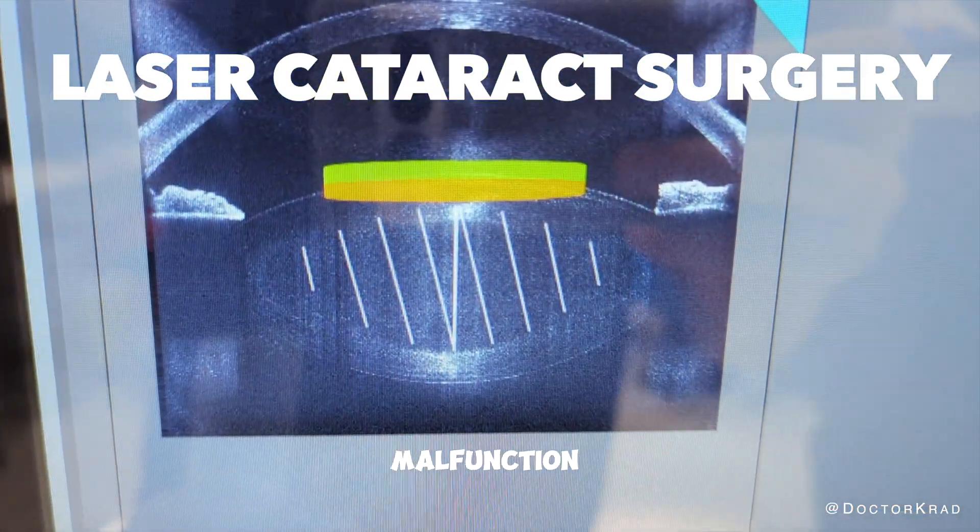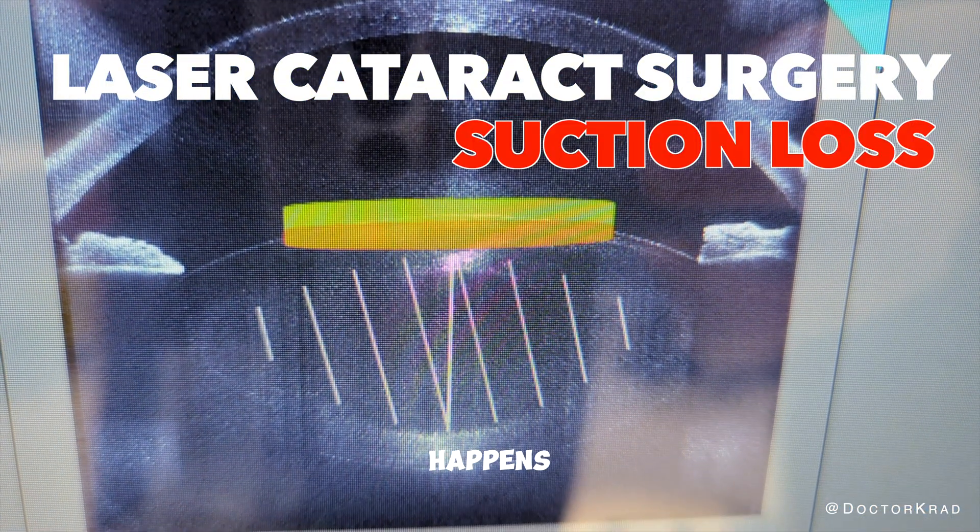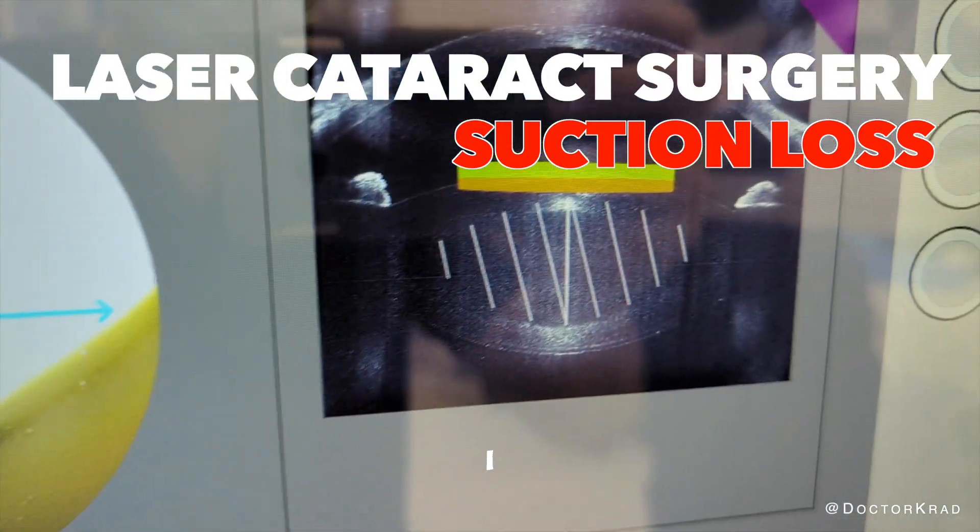It's Dr. Krat here. Can a laser malfunction in the middle of surgery? What happens if you lose suction and the eye moves? In this case, I will show you.